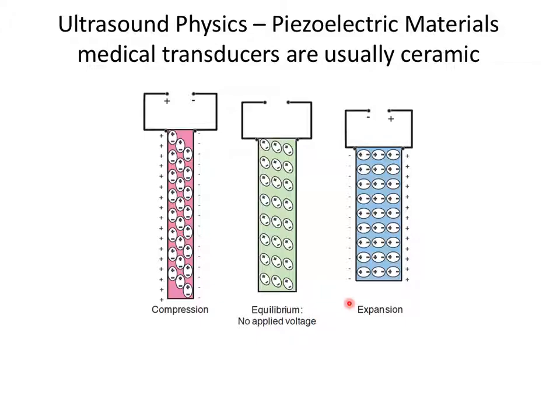And the interesting thing about this material is it's a crystal, so the molecules are aligned in a very regular pattern, right? And at 0 volts, if there's no voltage across here, they have a certain geometric alignment, a certain angle. Obviously you can cut the crystal whichever way you want to make that angle.